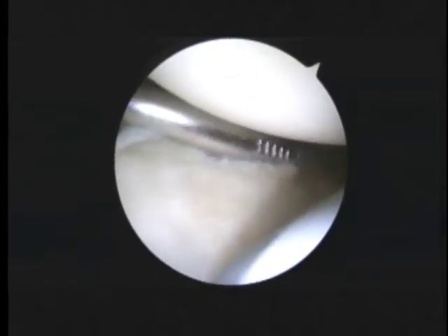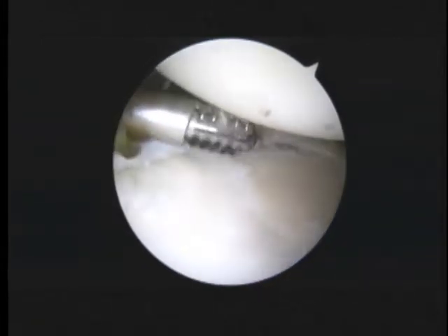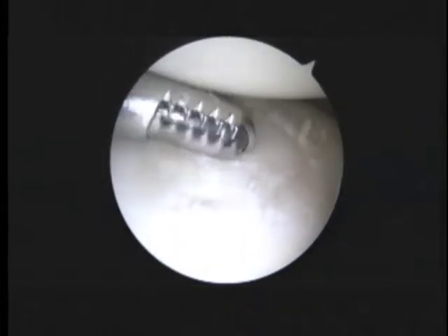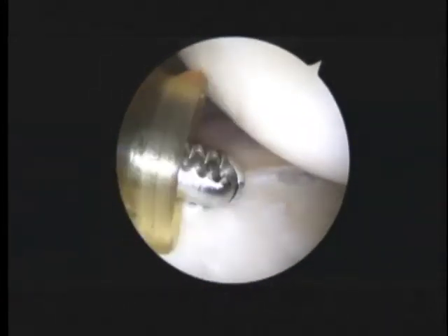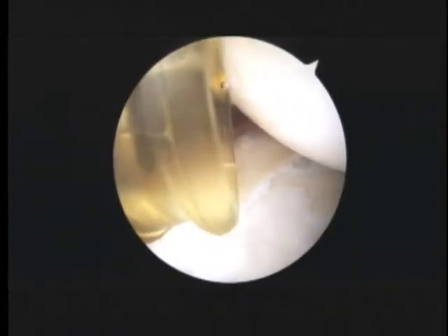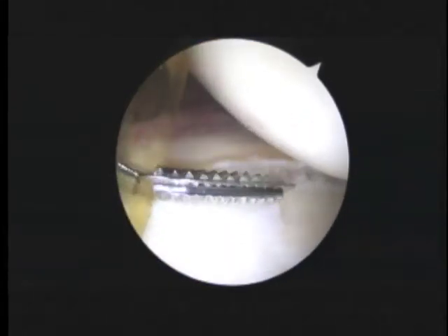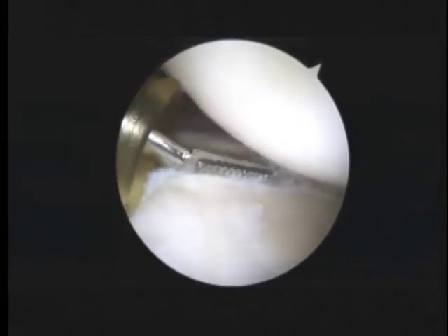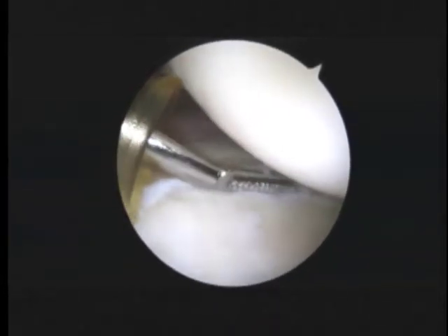The next step for us is to go ahead and put the camera in the front and have a look from the front to the back. Now we're looking from the front to the back. You can see this labral injury all the way to the back here. Let's see where this is a little bit loose — we're going to go ahead and take a grab.